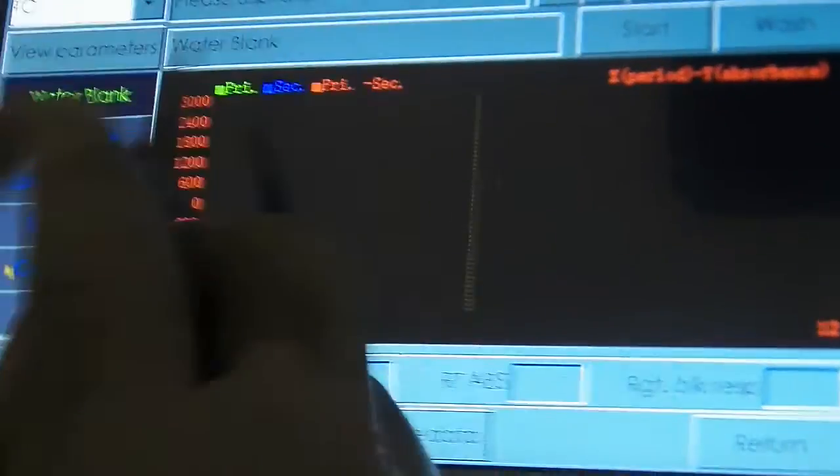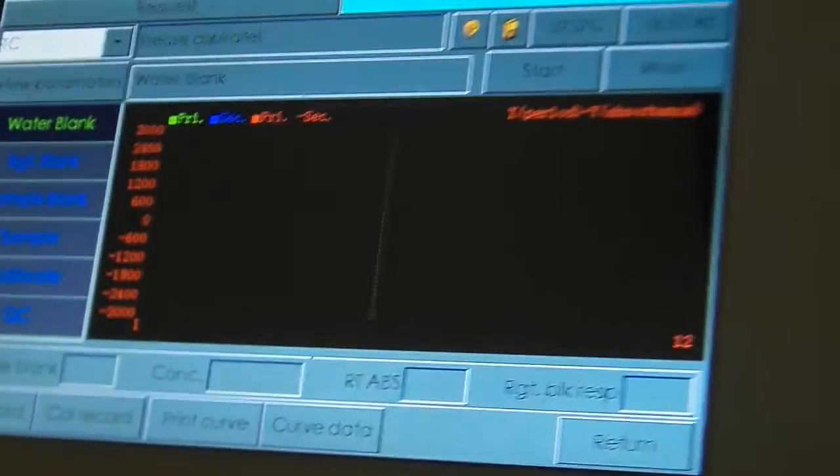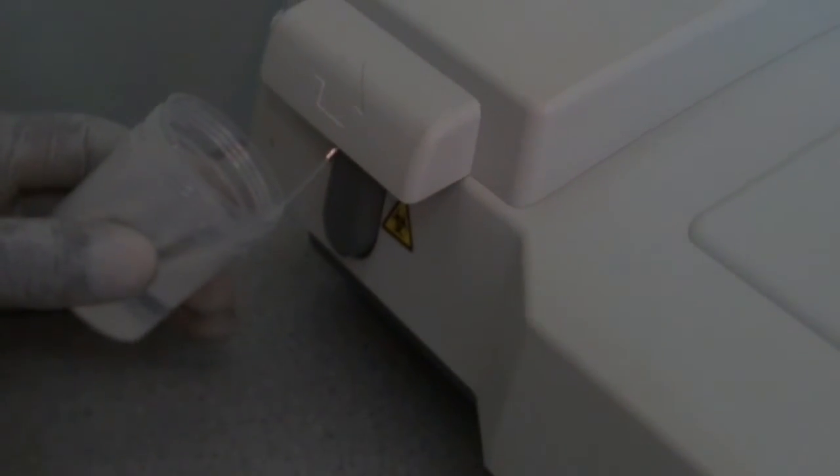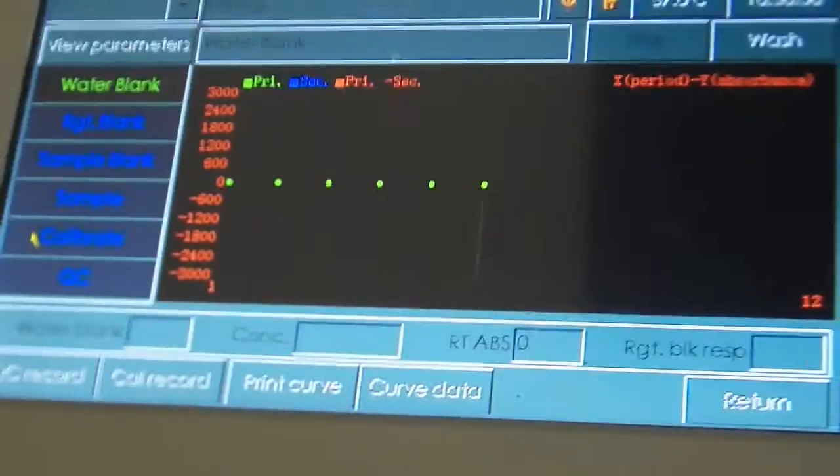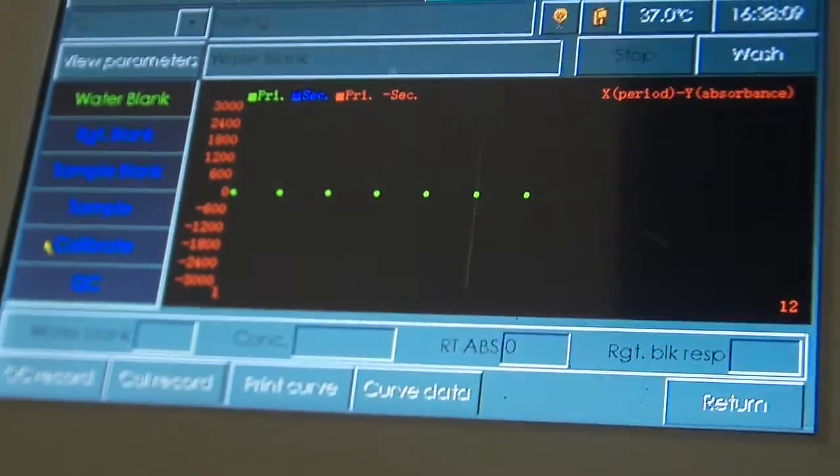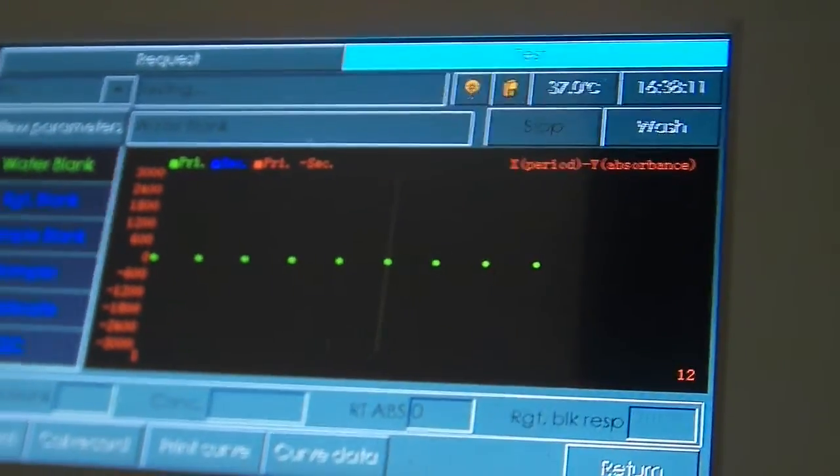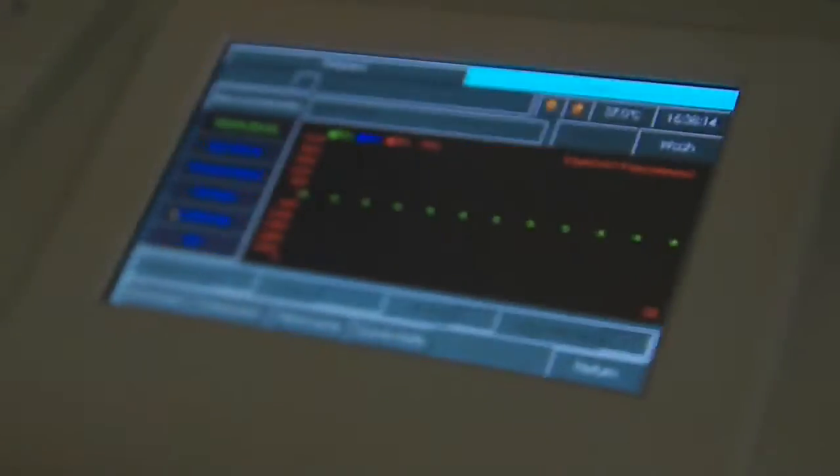So we have to water blank first. Always, we have to make sure we water blank first. I have distilled water right here. When the screen is running. When it beeps, it means it's ready now for the next.